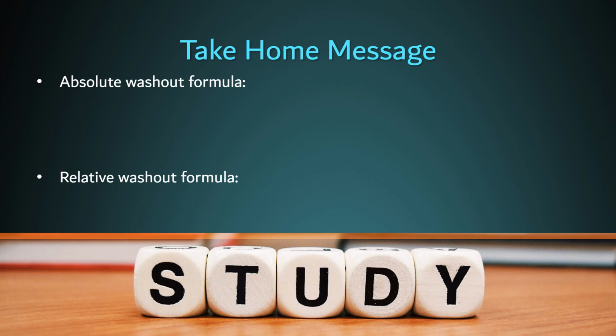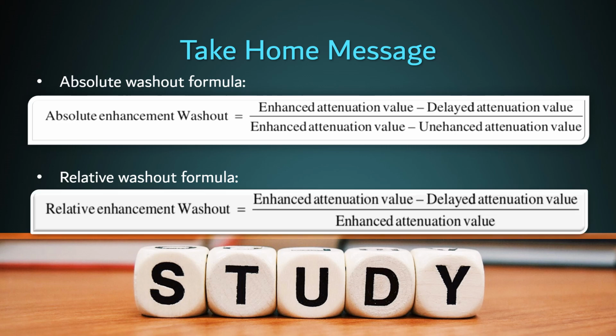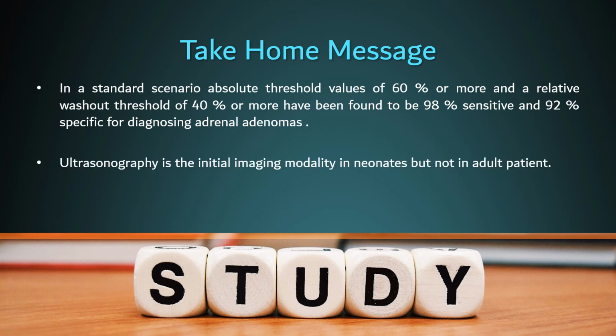The calculation of absolute washout and relative washout formula as shown here. Remember that in a standard scenario, absolute threshold values of 60% or more and relative washout threshold of 40% or more have been found to have high sensitivity and specificity, equal to 98 and 92 respectively, for diagnosis of adrenal adenomas.